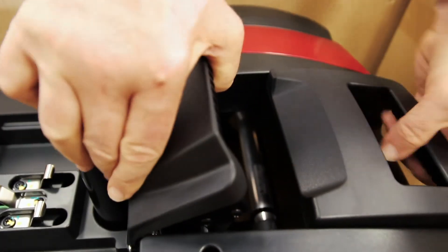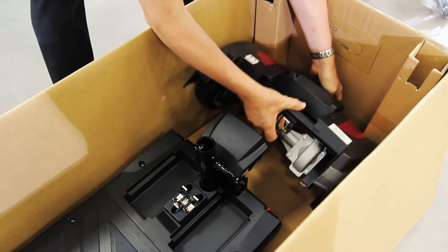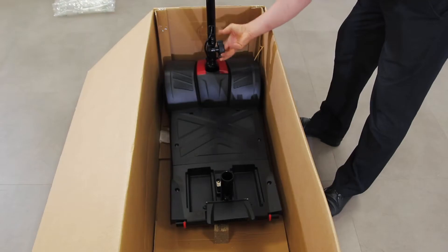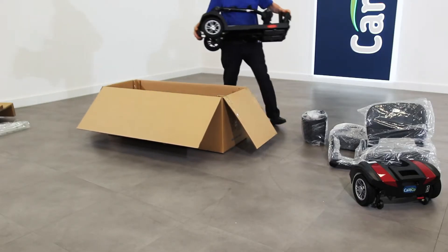Lift the lever on the back of the scooter to separate the front and rear sections. You can now lift out these two sections separately at a more manageable reduced weight. Lower the tiller before lifting the front section.